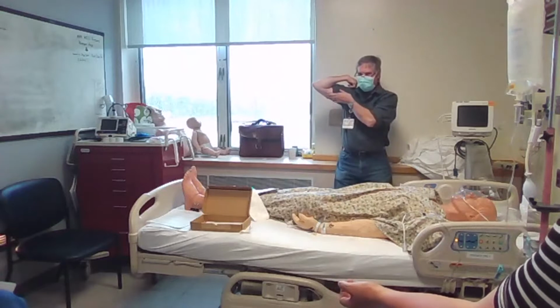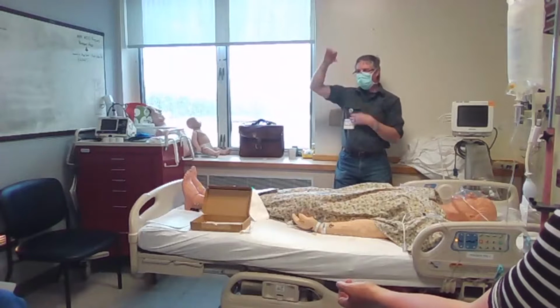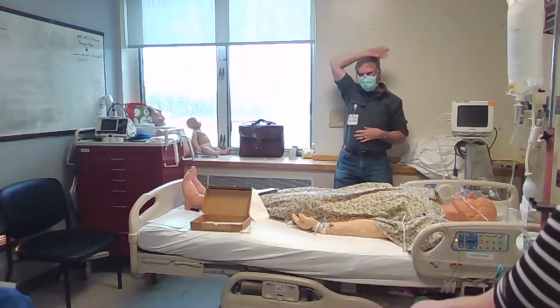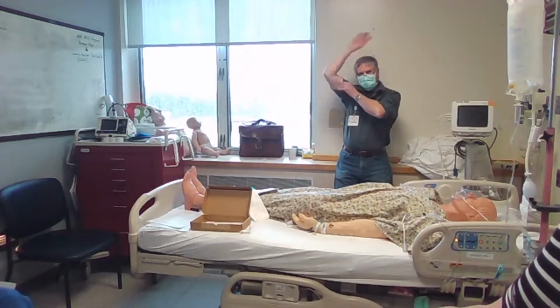Those tend to be really sensitive spots on a person though. Seems like an awkward spot. Yeah, the easiest way to do it is to just put their arm up above their head like this, just kind of normally, and then you have really good access to the arm. But if they're awake, it's really sensitive there.